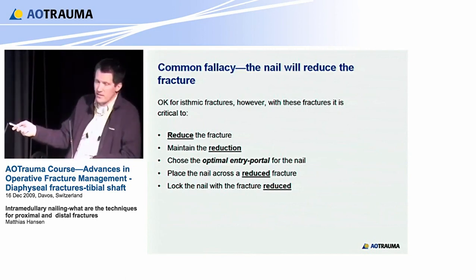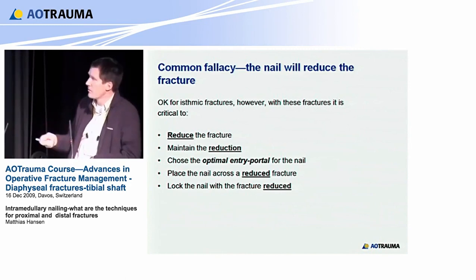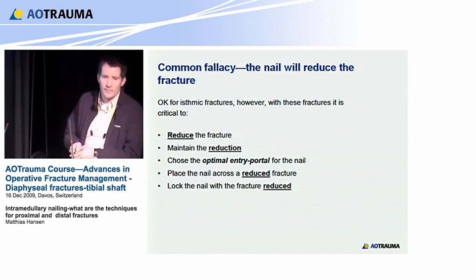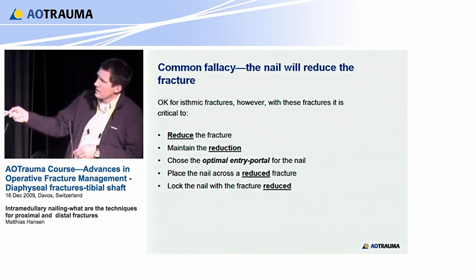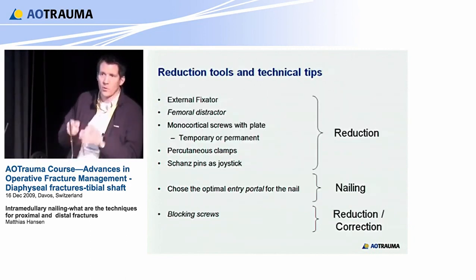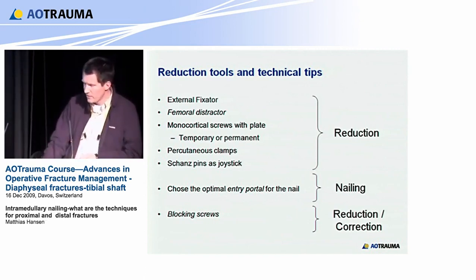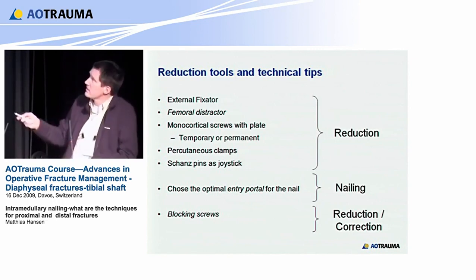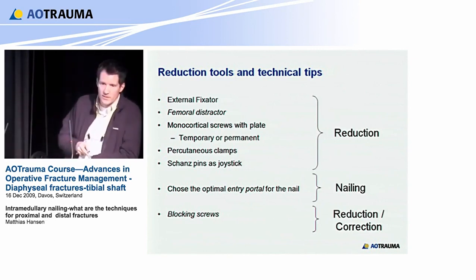Then maintain the reduction. Keep the reduction with passing the nail over the fracture, and keep reduction during locking the nail. In between all these reduction procedures, you have to look for the optimal entry portal for the nail to get little stress on your reduction. Therefore, I would like to show you some things as reduction tools and technical tips.